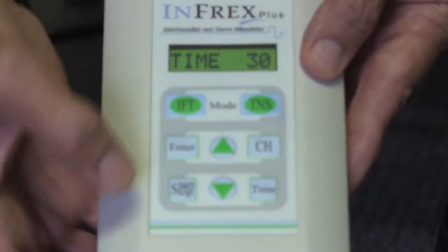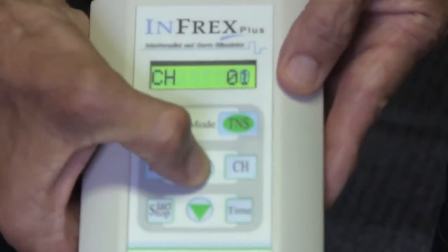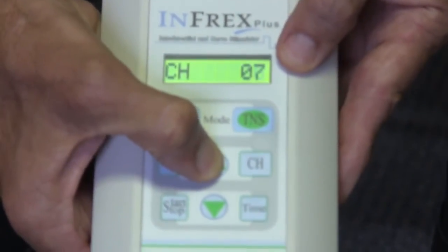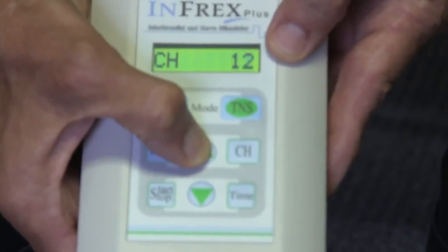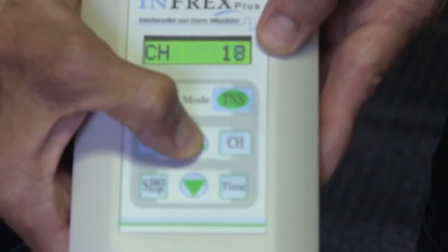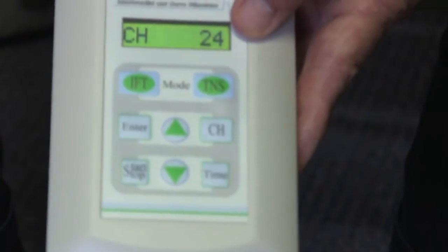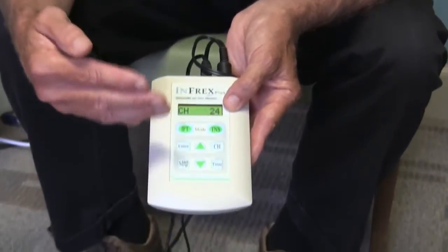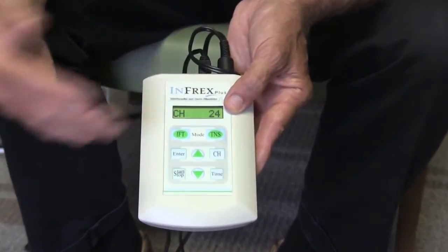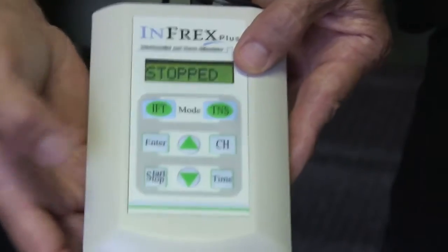Next, hit start/stop — we're ready to begin. It will say zero, showing there's no energy coming through yet. Push the up arrow and you'll see the numbers gradually change. At this point your electrodes are already on, so all you're doing is bringing the level up until it is a comfortable sensation. The number really doesn't matter — when it feels good, stop. You're now getting a stimulation that is comfortable to you, and the machine will treat you for the 30 minutes you set, then turn off. If you get tired, you can hit stop at any time.